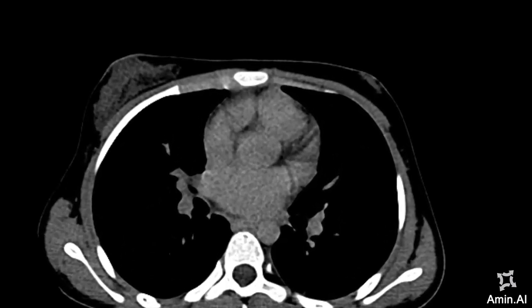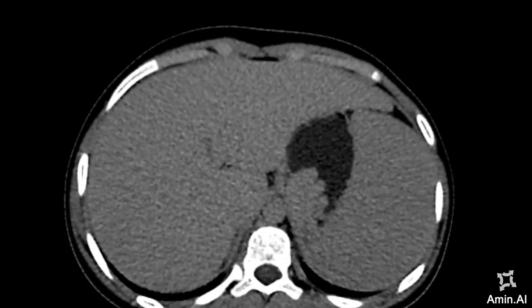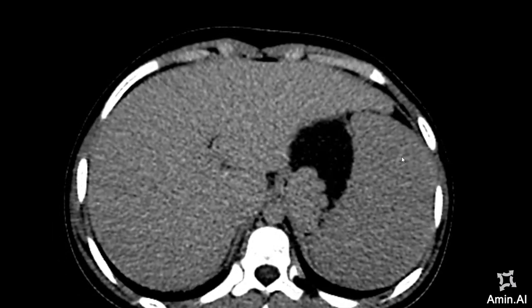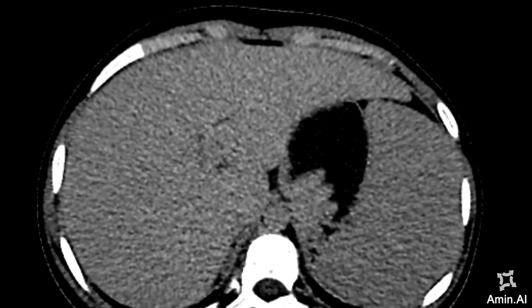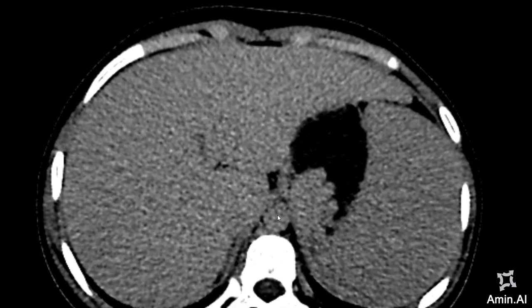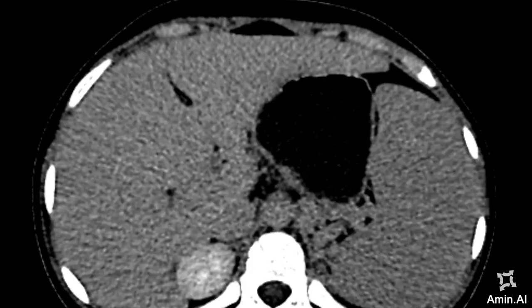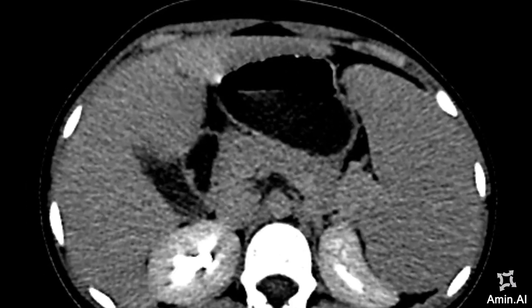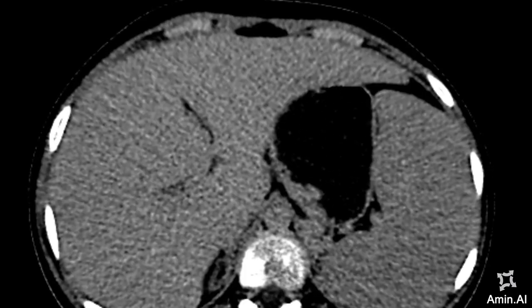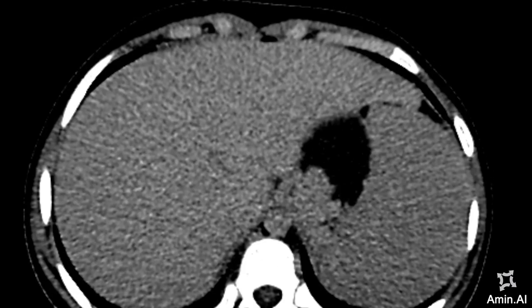On the delayed phase images, you can appreciate that the lesion has lost the contrast. It is showing reduced enhancement and is again almost following the enhancement or the attenuation seen in the adjacent vascular structures. This raises the possibility that this lesion is most likely a venous related structure, as it is clearly following the signals of the adjacent veins.